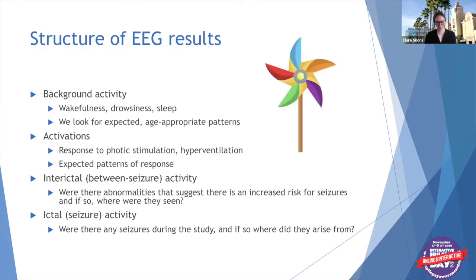And so that's just a picture of the pinwheel that your child will probably be given if they're old enough to cooperate to do the activation procedure of hyperventilation, where they'll typically ask them to do it for about 2.5 to 3 minutes.